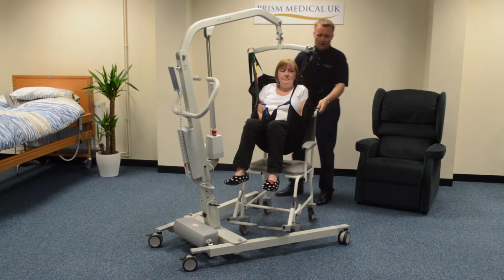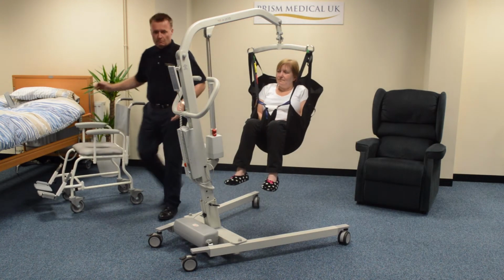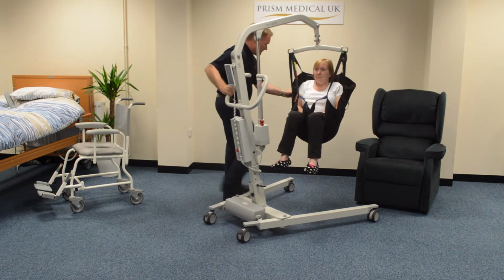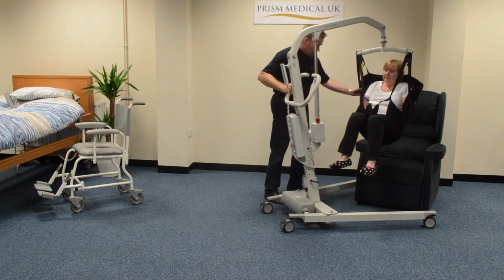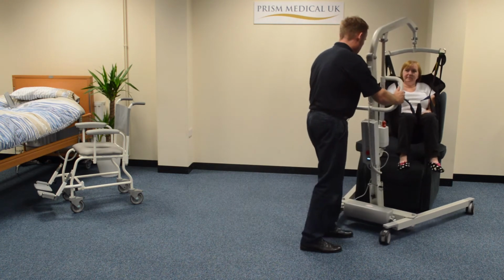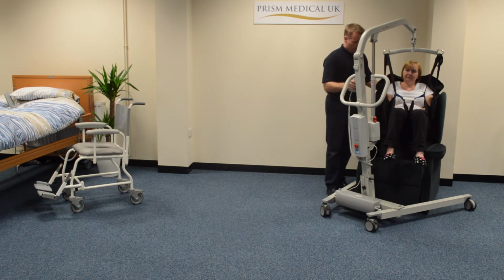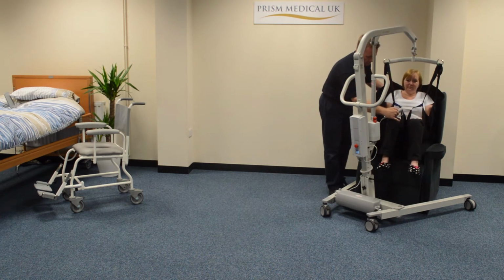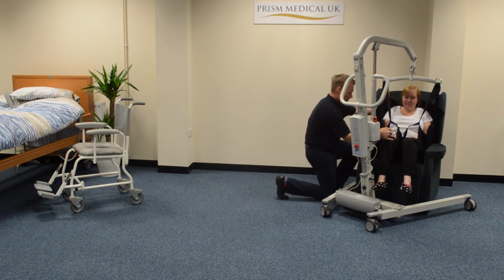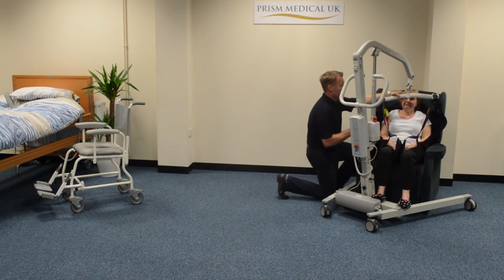Once Mary is clear of the chair, we can move the chair to one side and we can position Mary over the chair like so, and lower down. Ensuring that the carry bar is clear of Mary's face.